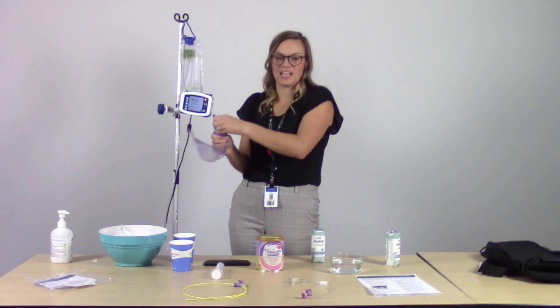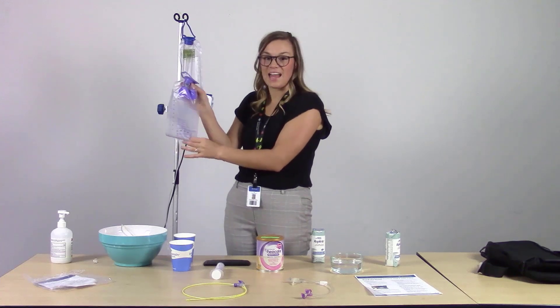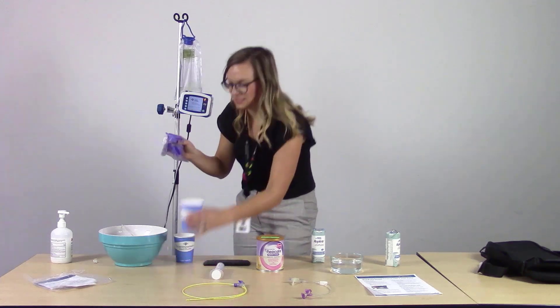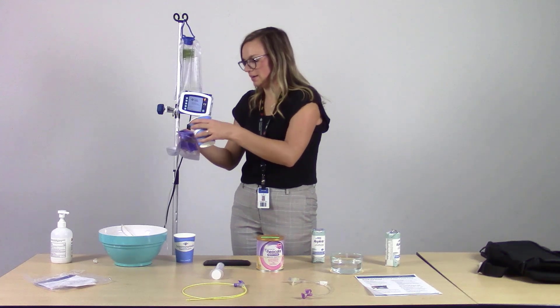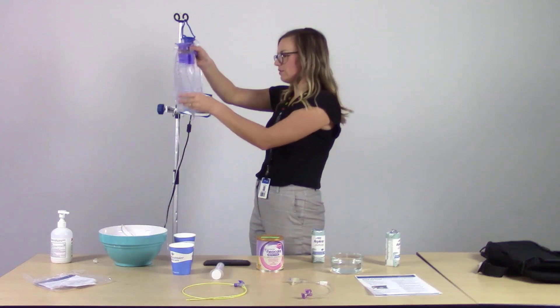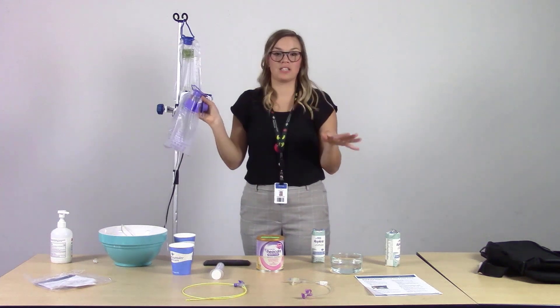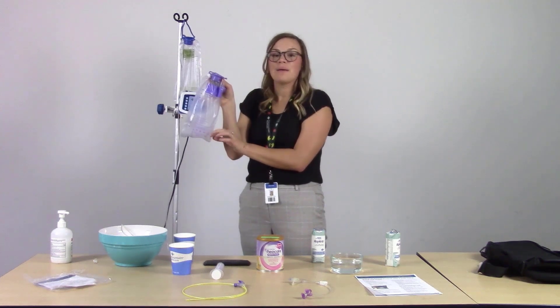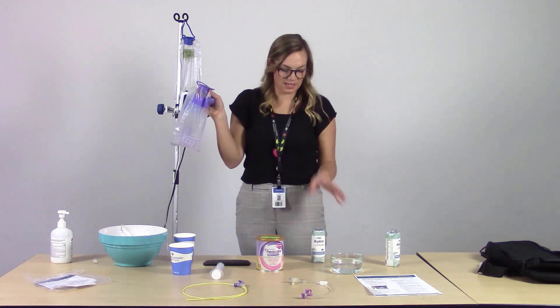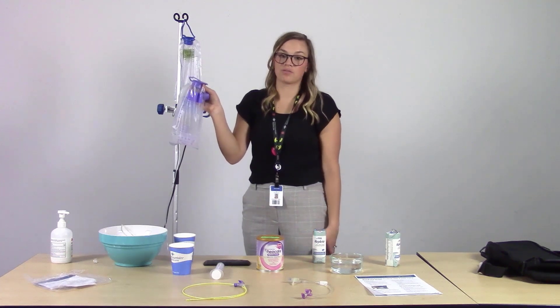Since we don't have a sink for our demonstration, we'll open up the feeding bag and pour warm water from the tap into the feeding set to rinse out any old formula before putting new formula in. We never want to put new formula on top of old formula because that can cause clogging. Hang times are 8 to 12 hours for a ready-to-feed formula, 4 hours for human breast milk or a powdered formula, and 2 hours for any home blended formula.